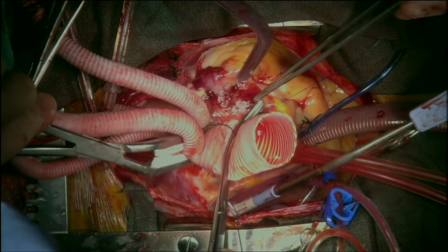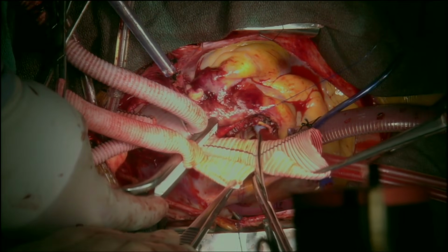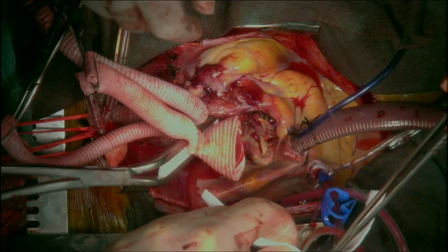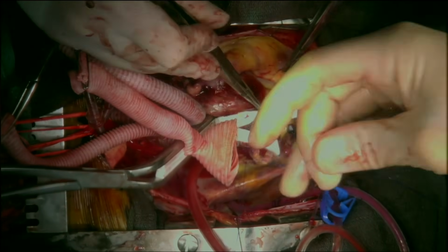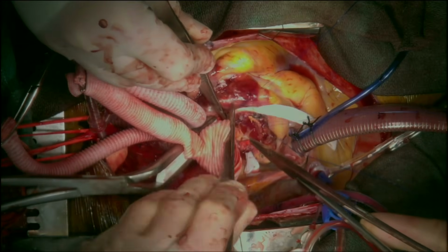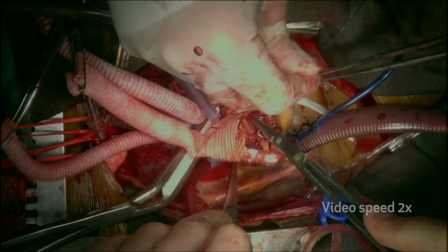The cross clamp was moved to between the first and second branch, and the proximal aspect of the graft was trimmed. The proximal anastomosis was completed with a running 4-0 Prolene suture incorporating a strip of felt external to the proximal aorta. The valve resuspension sutures were brought through the strip of felt and tied down along the way.